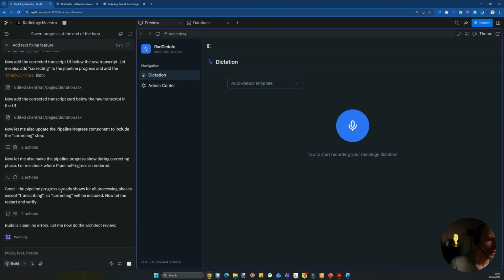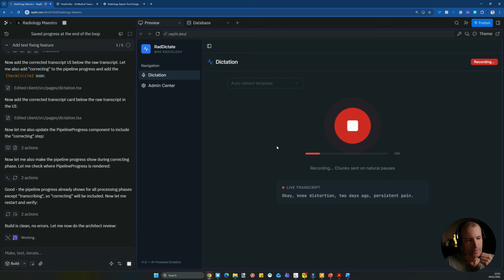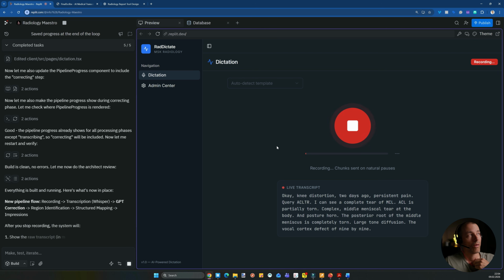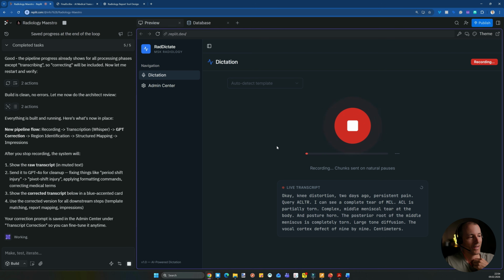And so hopefully this works. Now it shows it to the architect for review, so we can maybe try. Okay, knee distortion 2 days ago, persistent pain, query ACL tear. I can see a complete tear of MCL. ACL is partially torn. Complex medial meniscal tear at the body and posterior horn. The posterior root of the medial meniscus is completely torn. Large joint effusion. Deep focal cartilage defect of 9 by 9 centimeters. Oh no, millimeters. And the retropatellar cartilage.